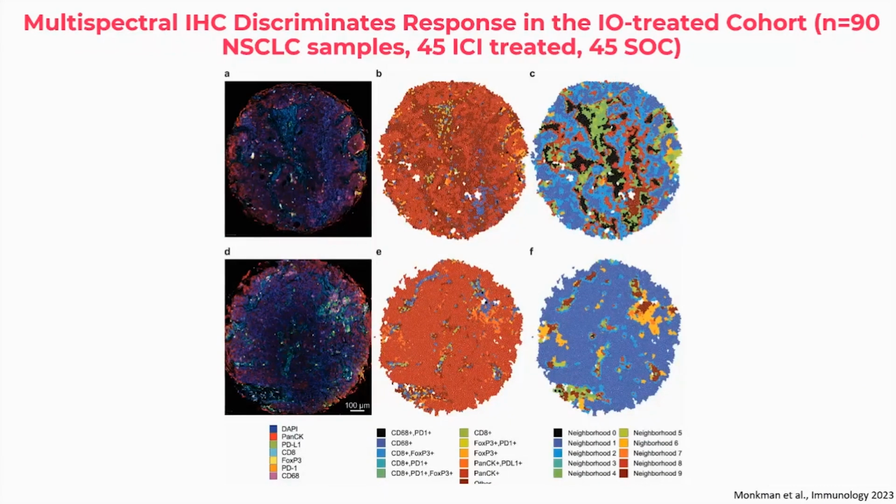So a cellular neighborhood is using a k-nearest neighbor analysis. It's saying that my tumor cell might be next to a CD68 cell, might be next to a FOXP3 expressing cell, and so on. We identified each individual neighborhood within each individual patient sample or core, and then we extrapolated it to the 90 patient cohort.